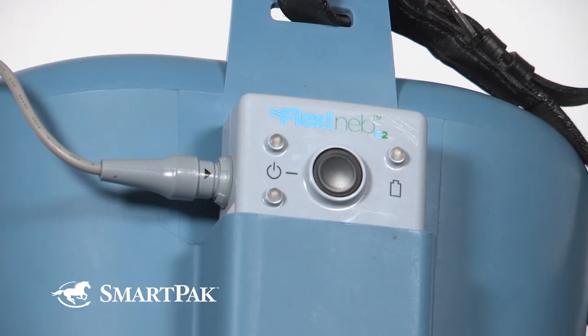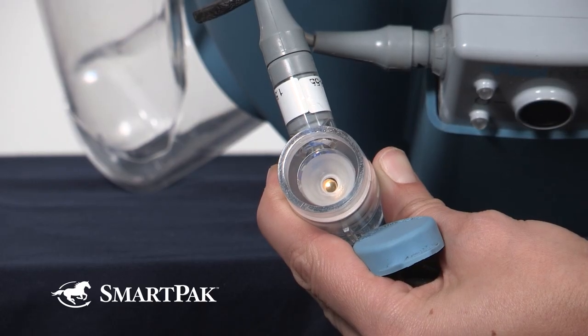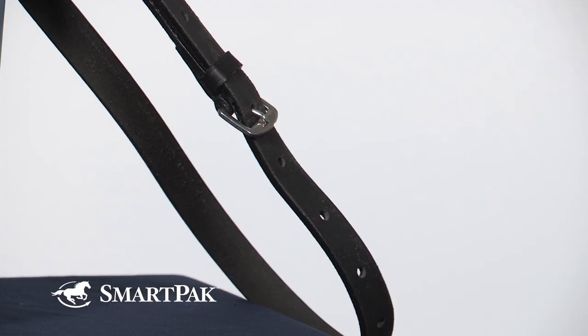I have two nebulizers because I use them on two different horses. They are both 15 hands, but one has more of a warmblood horse head size, so he has the normal horse size nebulizer. The other horse has more of a small Welsh cob head, so he has the pony size nebulizer. And if it doesn't fit, you can exchange it with SmartPak's free return shipping.